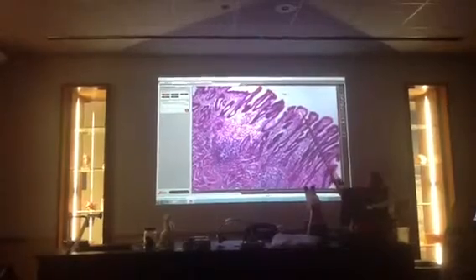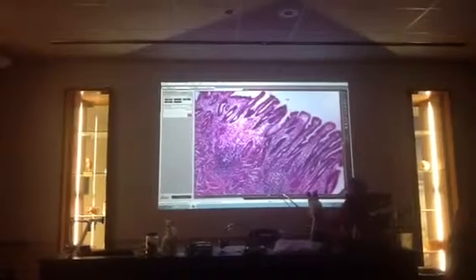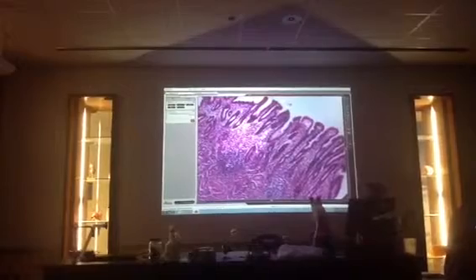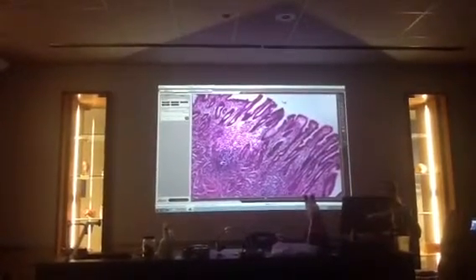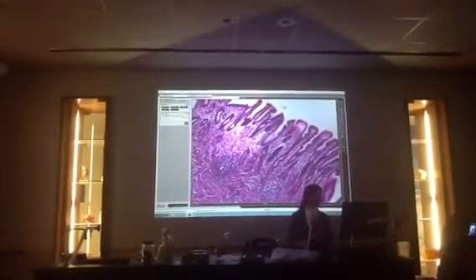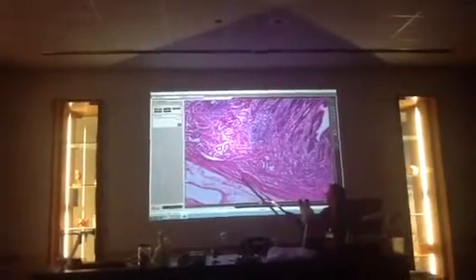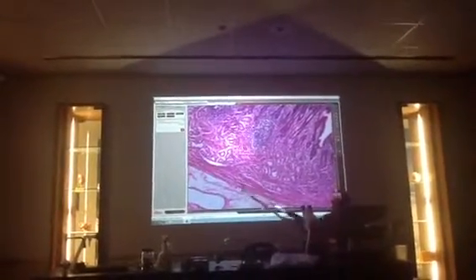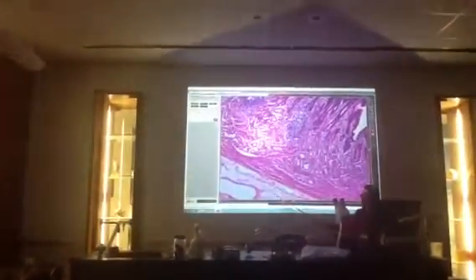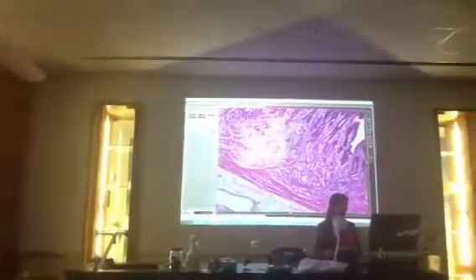Again, all the inside material, that's all lamina propria. And then the gastric glands are all of these circular types of structures. And then the bottom edge is the muscularis mucosa for the whole mucosa layer. And then this would be what layer? Submucosa. Remember, it doesn't look like much. You really don't have to know any structures in it, it's just submucosa.